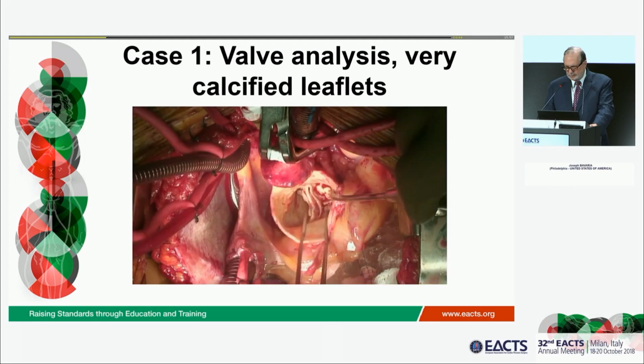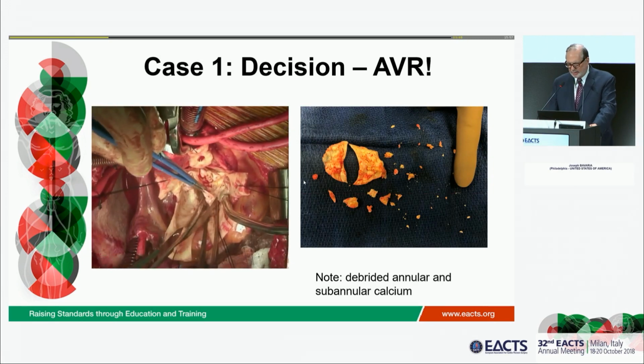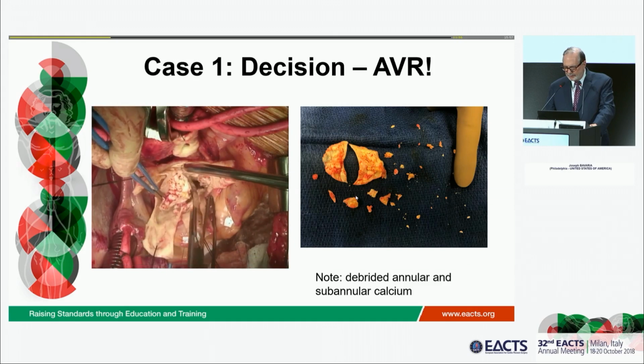And we abort, and I'm taking the decision towards an aortic valve replacement. You can see that we have a very calcified valve here. And we put a big valve in this.